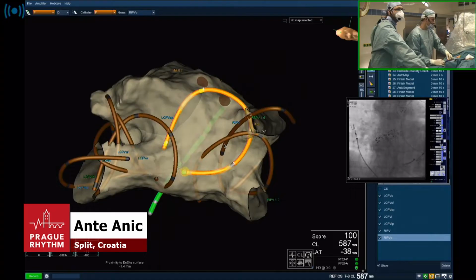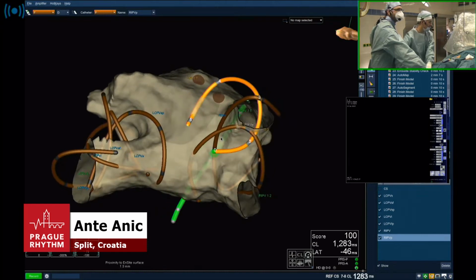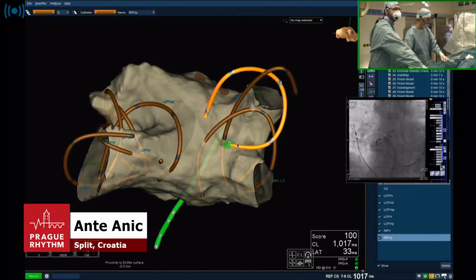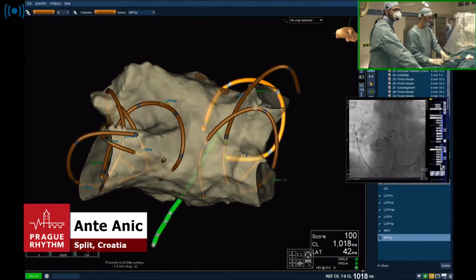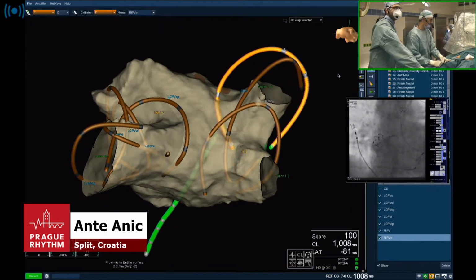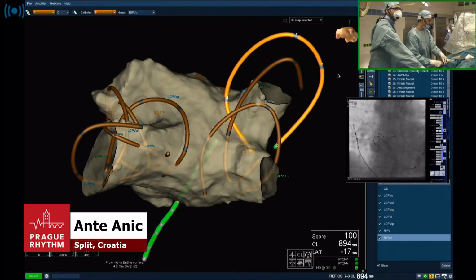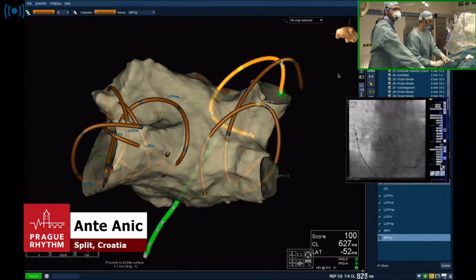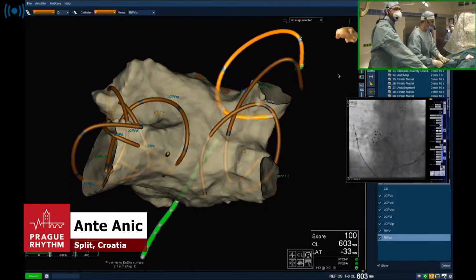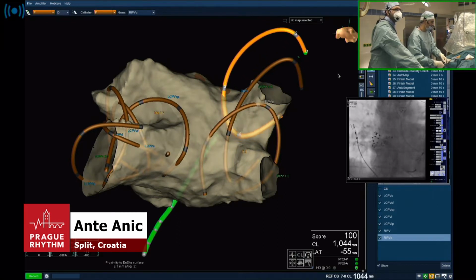Sorry. Just let me try with the wire. Actually, I'm not using it. This is the inferior branch. Superior vein. I like that. That's no problem. So the first application to the right superior is always in the flower. Let me do this. I want to rotate more. I'm trying to find my way. It goes to the inferior branch.